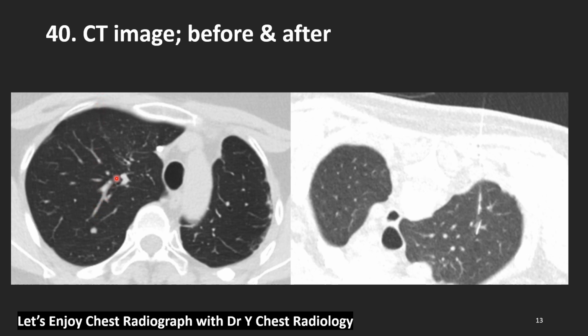And there are so many pulmonary vessels. These vessels look so dangerous to me. So I decided to go from the backside, short distance with fewer pulmonary vessels. So the patient is in prone position from backside.